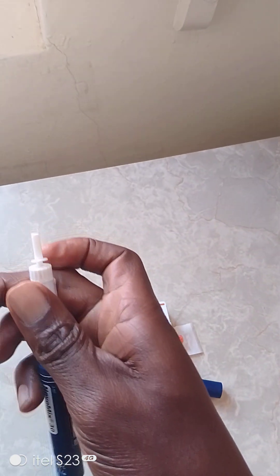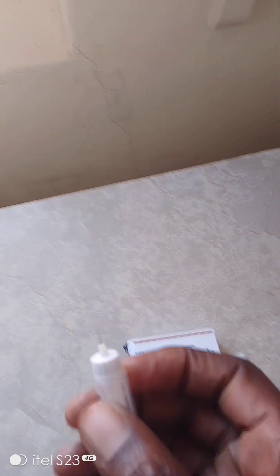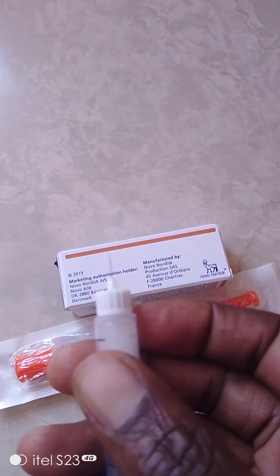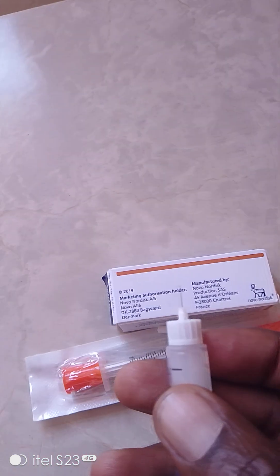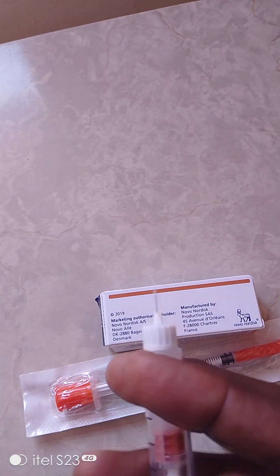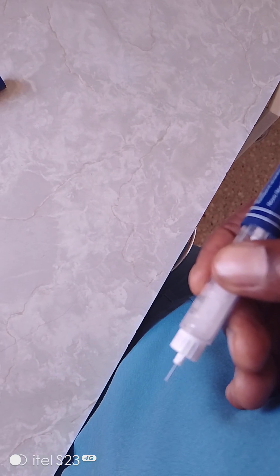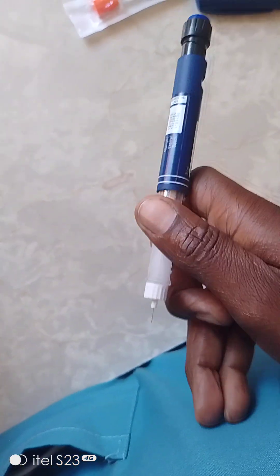Now remove the stopper. When you remove the stopper, you'll be able to note that there is a small needle there - it's very thin. That needle is very small and it's meant for subcutaneous injection. When injecting, you don't need to bend the needle to search for subcut. It's been measured - just go 90 degrees on the tummy, straight.